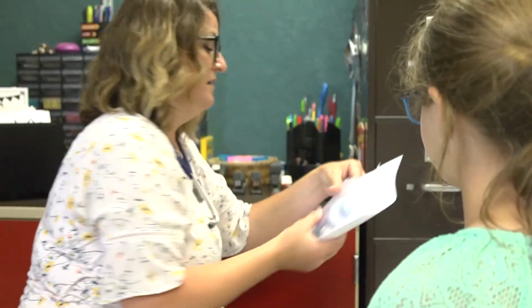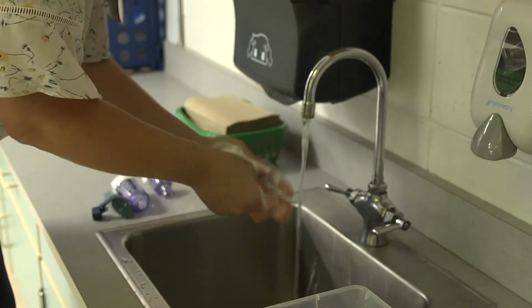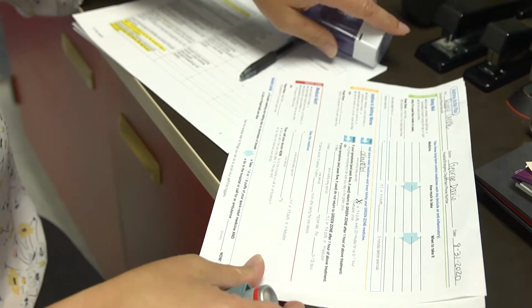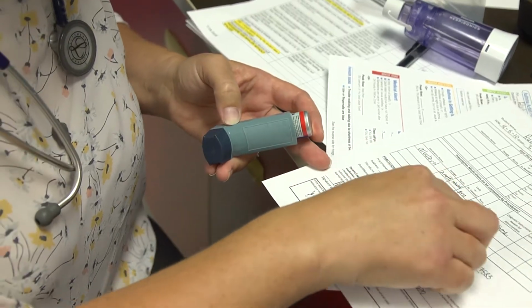Position student, providing as much privacy as possible. Wash hands. If student will be administering medication, have student wash hands. Check for authorization forms or record. Review the medication administration form, the medical provider form, and the parent-guardian consent form.